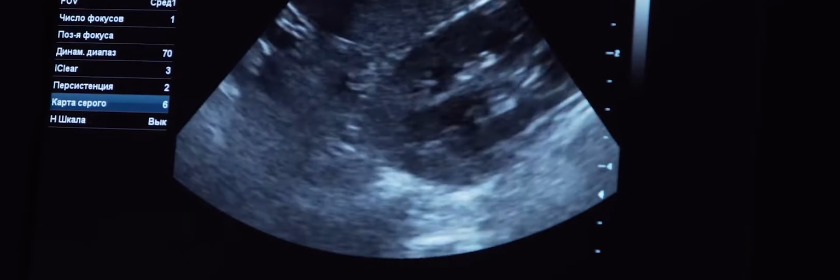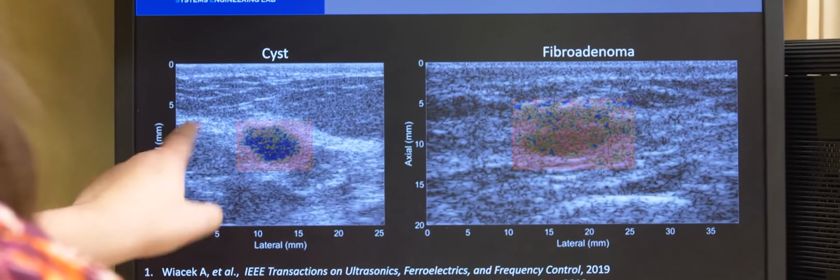Sound waves scatter irregularly through human tissues, and the machines can't tell the difference between a wave that bounces directly back to the sensor and one that bounces around before returning. Today's ultrasound software sums up all the data, good and bad. The resulting images are muddied with what's called acoustic clutter. Clutter is responsible for almost all uncertainty in ultrasound imaging.